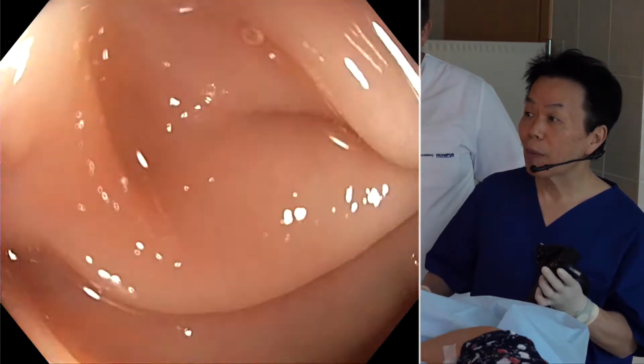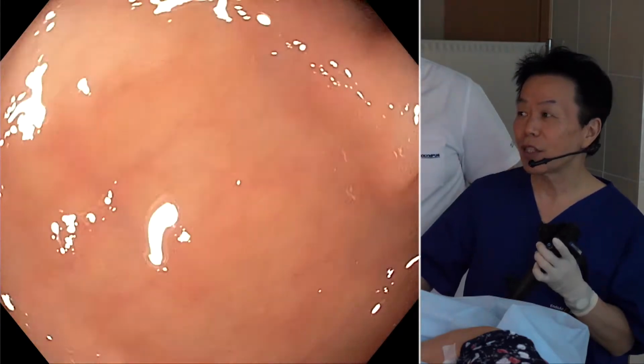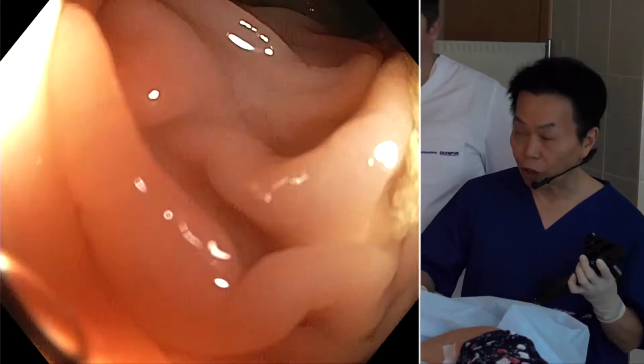And I have short fingers, so I do use the up-down angle, but I seldom use the right and left angle. My fingers are too short to move the right and left angles, so I often use rotation, clockwise and counterclockwise rotation. And I try not to push too much during the insertion.